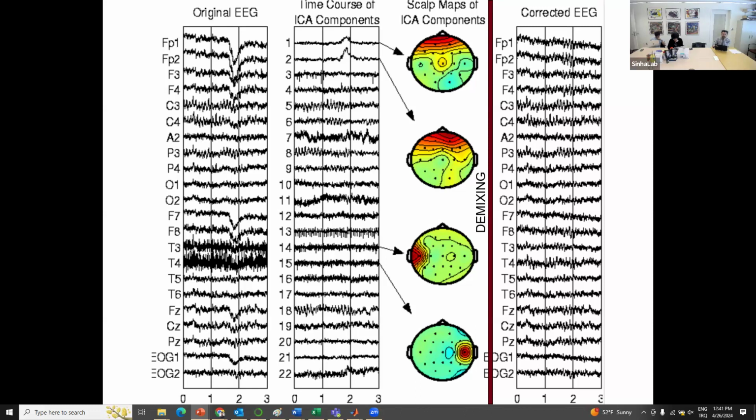But there are also other artifacts, like those due to your mimic, or due to your brain, for example, not focusing or paying enough attention to the task. These also create different artifacts in the EEG signal. So you have to use artifact removal algorithms, one of which I'm going to touch upon today. But just know that there are multiple other artifact removal techniques.